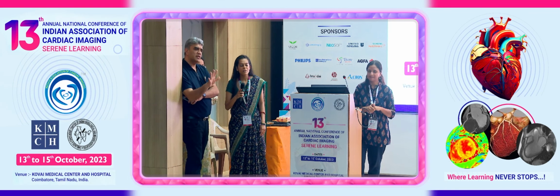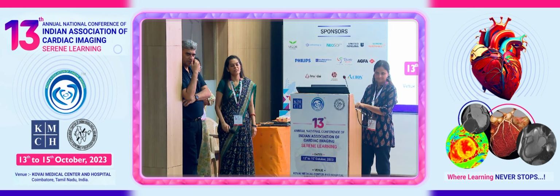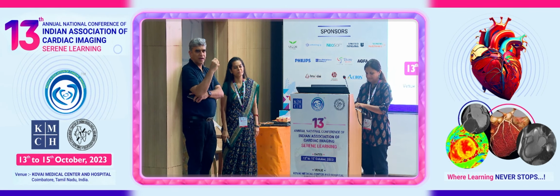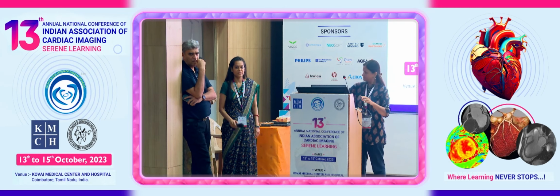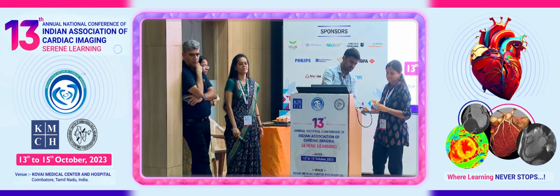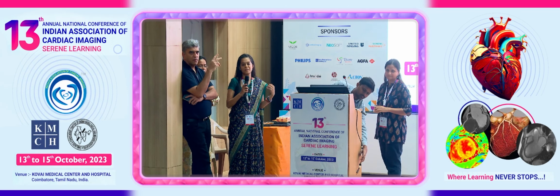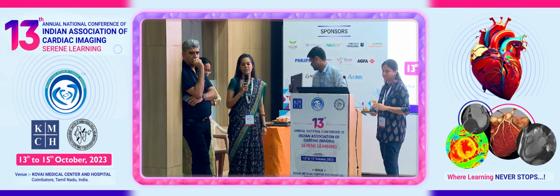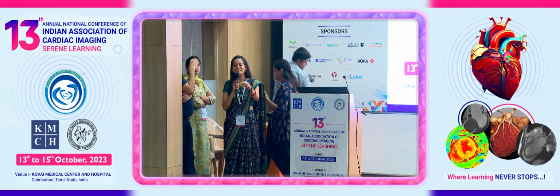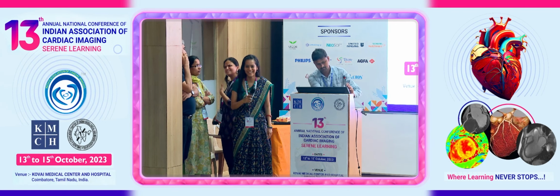Just make the baby quiet. The point is the speed is so good. The children are fasting. Just before they go on the table, they are fed, and immediately they go off to sleep. So they are tightly wrapped and put on the table. These high pitch sequences are also very helpful. It's just a 3-second scan. The z-axis itself is so small, so it's very quick.